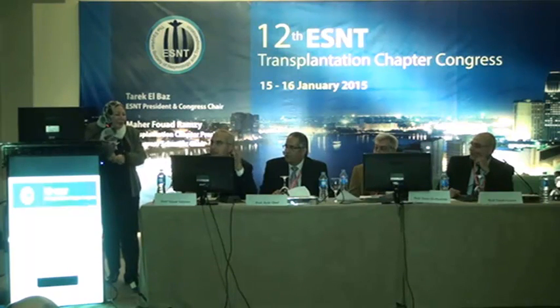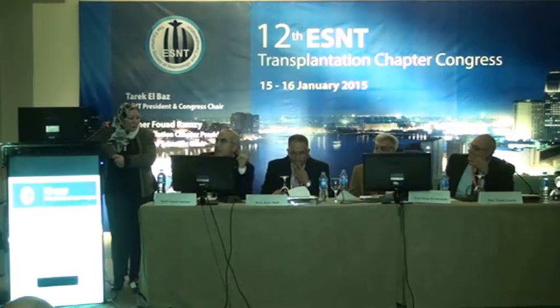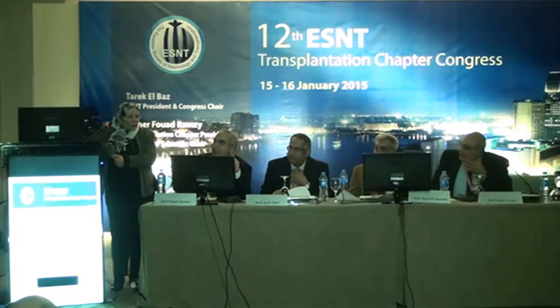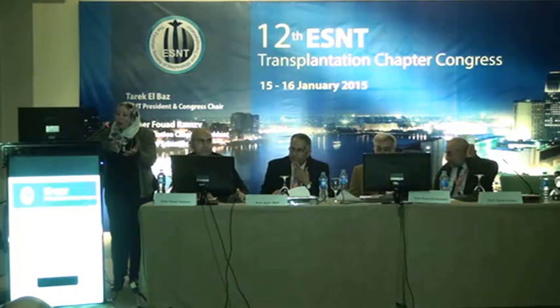So about 7%. She said 15% of them, and forget about virtual cross-match. I'm asking a different issue because virtual is not allowed. 7% of them virtual positive or negative. That's what I'm saying. We used to do CDC and flow cytometry before. So 25% of 7%. Yes, exactly. So it's a very small percentage, and this shows the importance of the virtual cross-match actually.